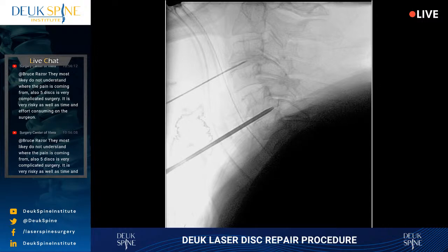That's as good as we're gonna get it right there. Shot. So a lot of times I get to these really collapsed discs and we're just gonna do it without the injection. So these collapsed discs, if you remember what I said earlier, they're full of inflammation and scar tissue from chronic inflammation. Chronic inflammation means inflammation lasting more than 3 months. And for a lot of these people, it's years and years.